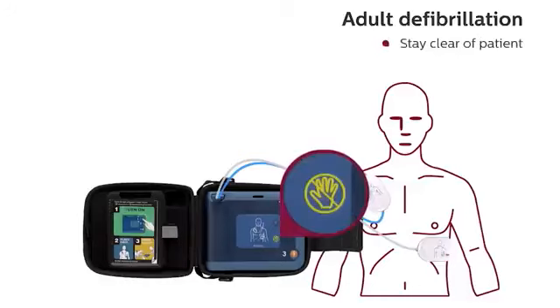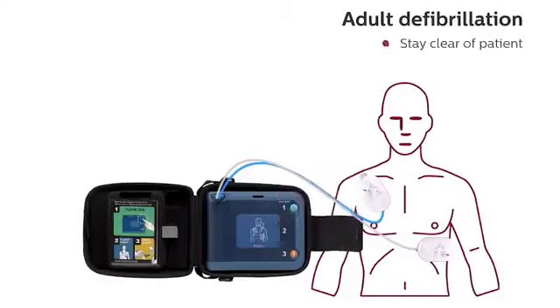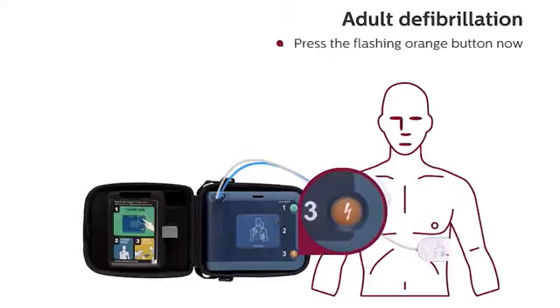Stay clear of patient. Analyzing heart rhythm. Shock advised. Stay clear of patient. Press the flashing orange button now. Deliver shock now.